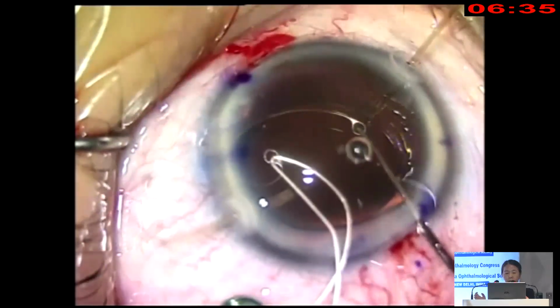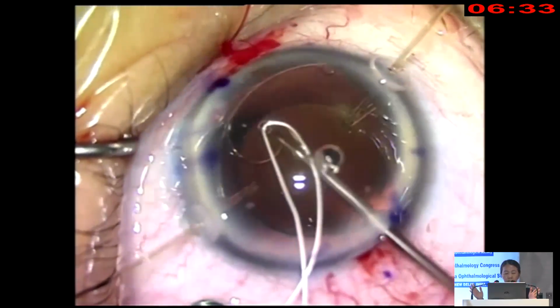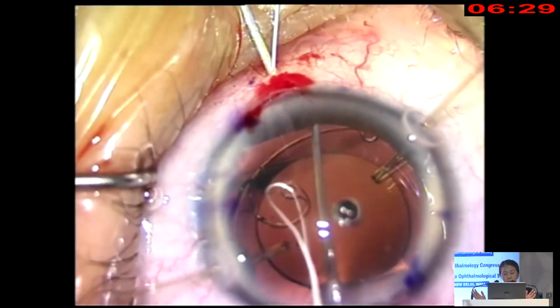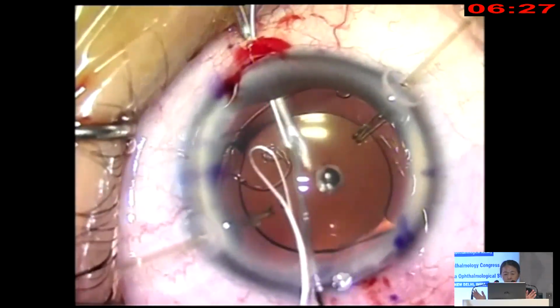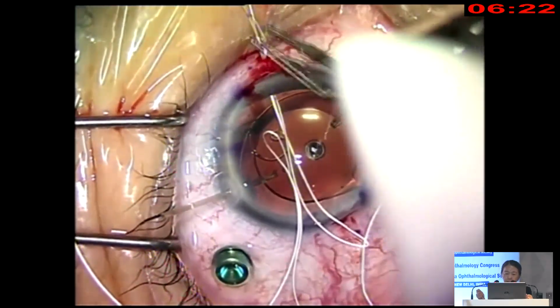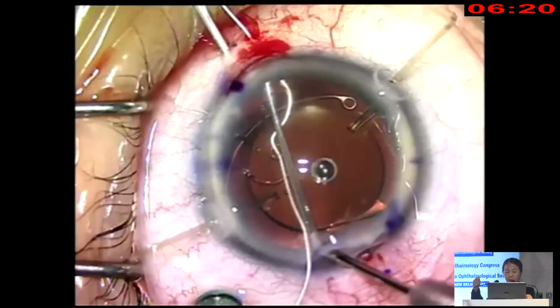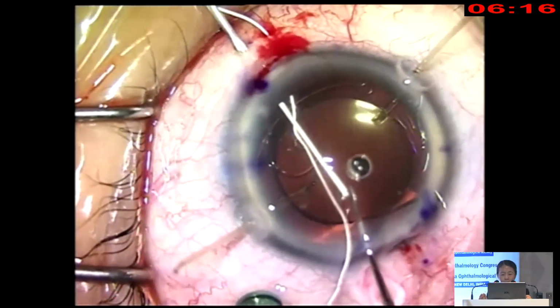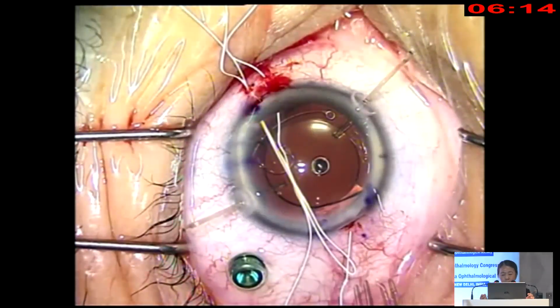Okay, so after creating Hoffman pockets, in this case, definitely with only like 2 clock hours of zonules intact, I will need to actually do 2-point fixation. So the CTS goes through a 2.2 mm incision very easily. The 1.8, when I put it in, I just kind of curl the fixation eyelet a little bit more, and it will slide through a 1.8 mm incision, right? Especially if you're doing pediatric cases.